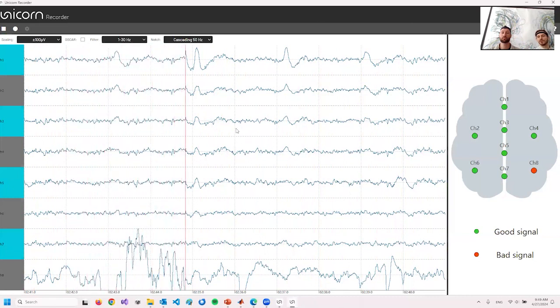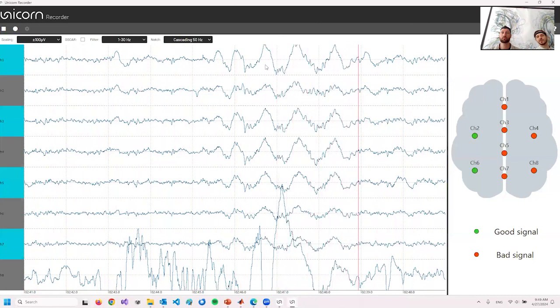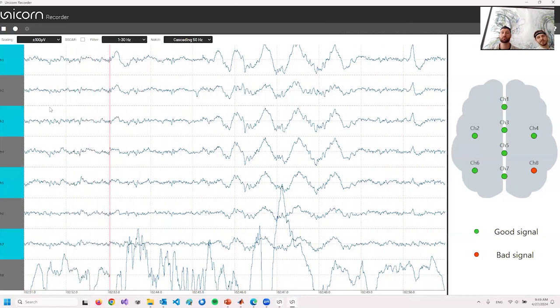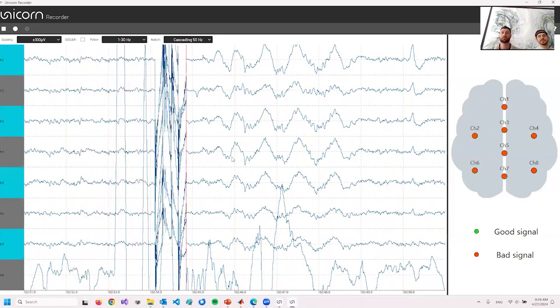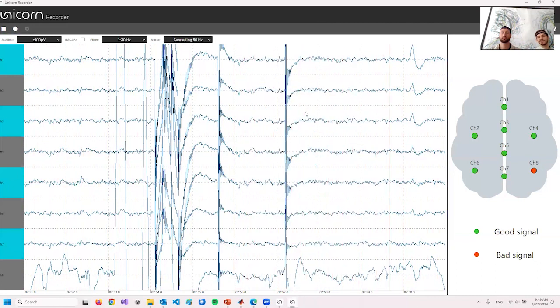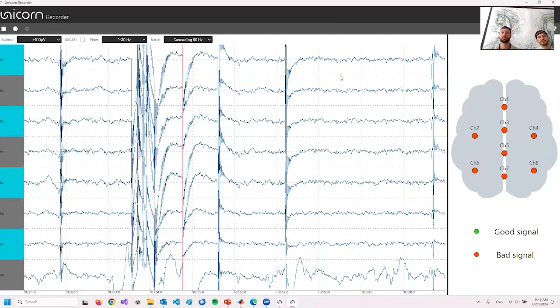You can roll your eyes a bit. Now you can see some EOG, like some electrical potentials added to the signal by your eyes. And now we can measure some real EEG. So the signals that you've seen right now are mainly artifacts.